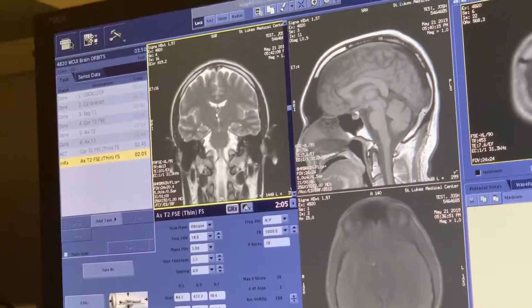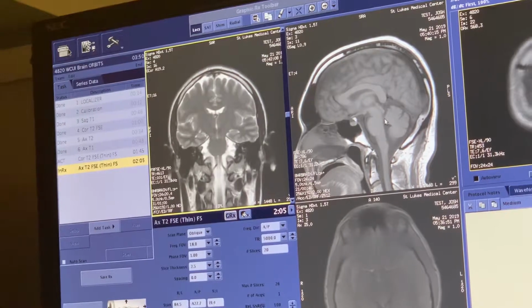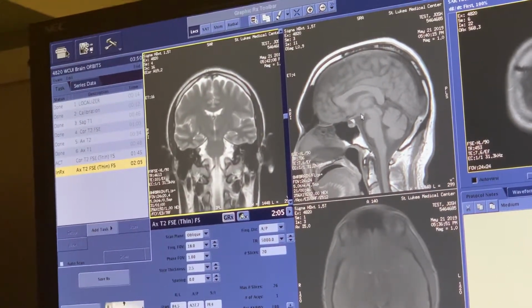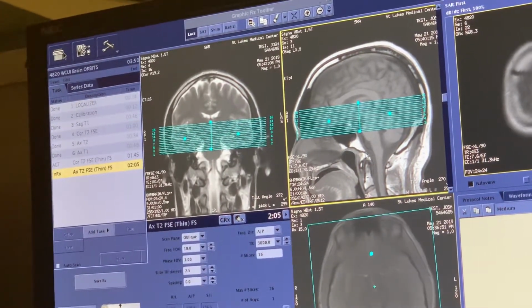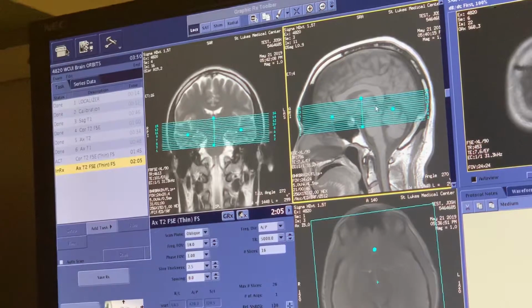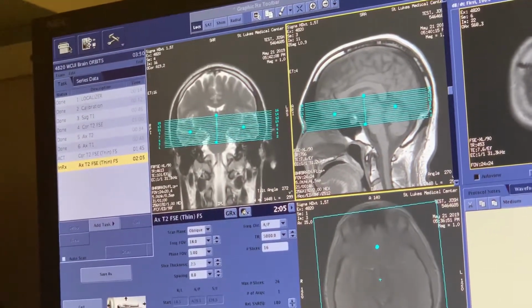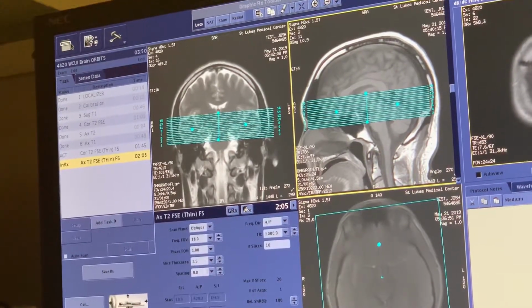So I'm going to do an axial. Again, if I'm doing an axial, I like to throw down in the sagittal plane, so I'm going to go ahead and do that. Boom. And again, we want to make sure that we are scanning an axial, which we are, right? Very much an axial, and that we're going from inferior to superior, which we are. So the only trick in this protocol is that you have to remember in the coronals to switch the direction.